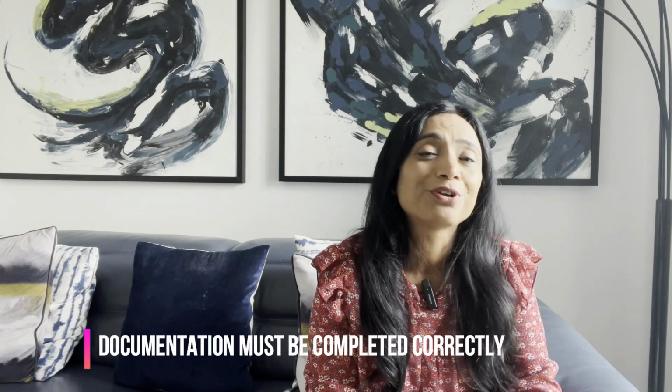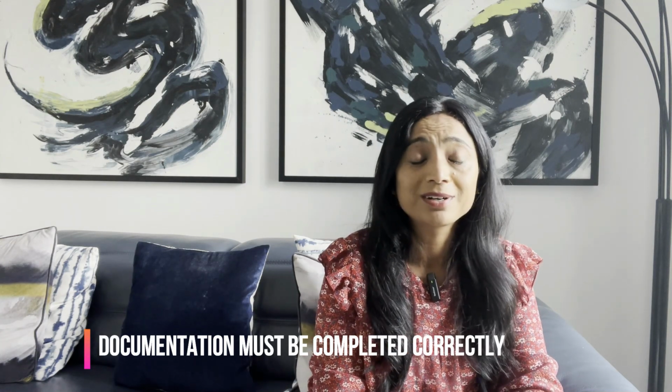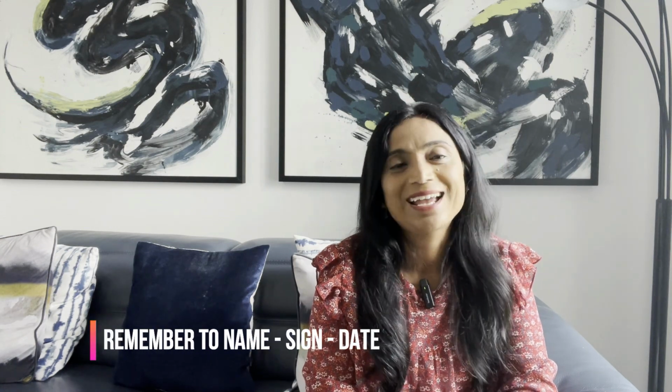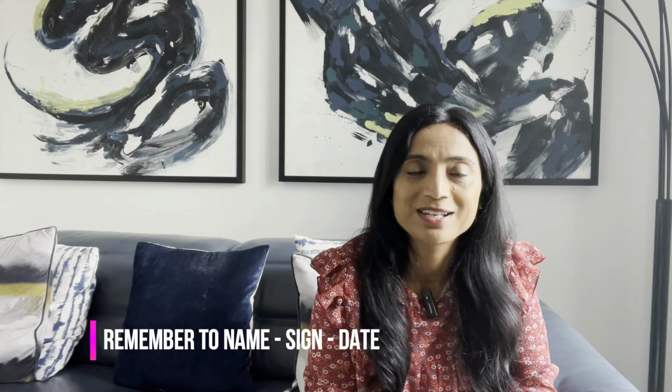Tip number 4 is your documentation. Make sure you do not forget to complete your documentation. Sometimes you put your 3 readings and you forget to add the final reading. That's really important that you add the final reading. Tip number 5 is do not forget to print your name, signature and the date. So that's really important, because lots of fails happen sometimes on simple mistakes like that. So these were my 5 top tips for this station.